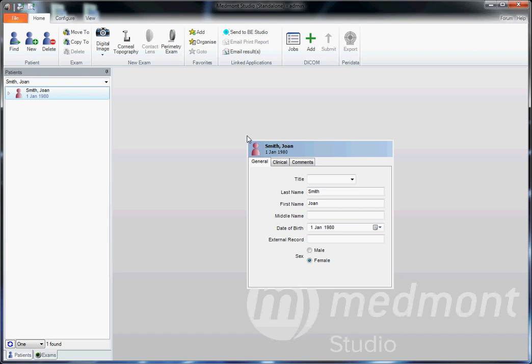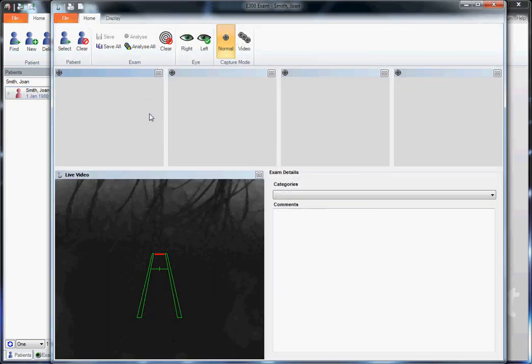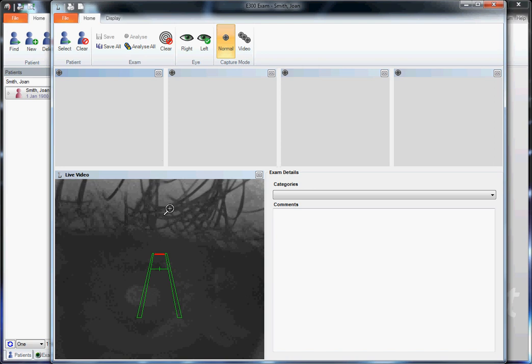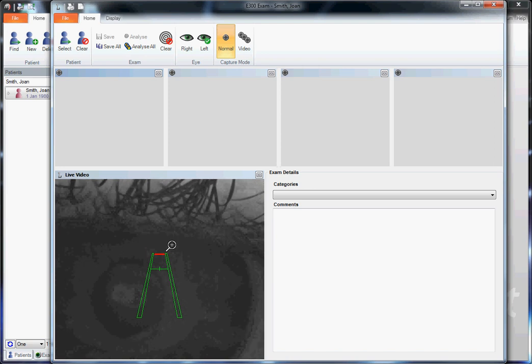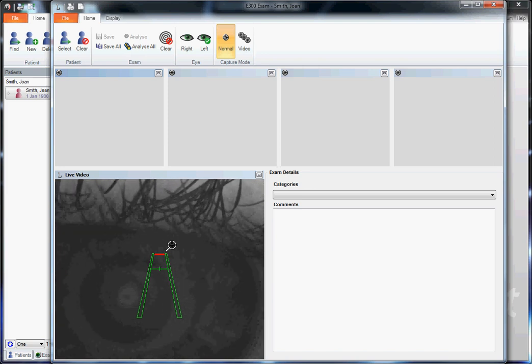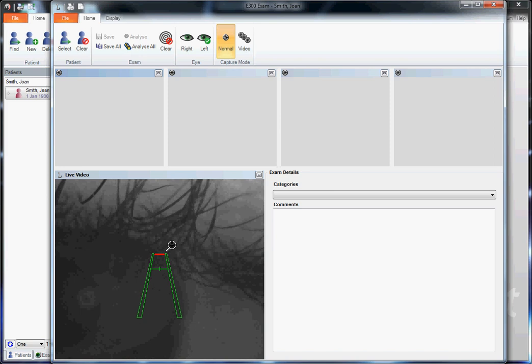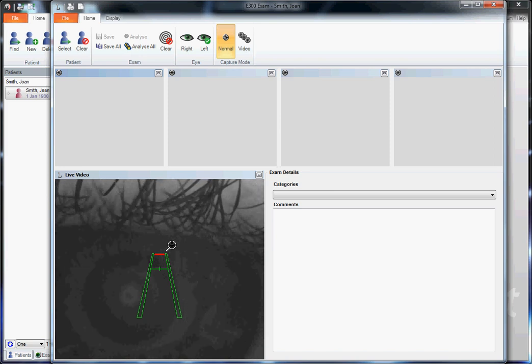This video covers capture basics with your Medmont E300 corneal topographer. Start by creating a new patient or selecting from an existing patient, then click on capture corneal topography. Seat your patient comfortably so they can be steady and smooth when you're about to take your photo.